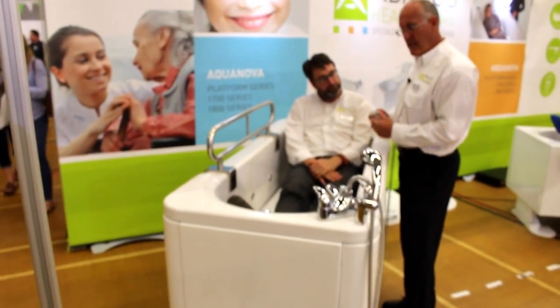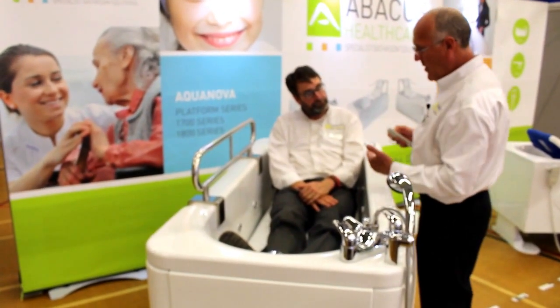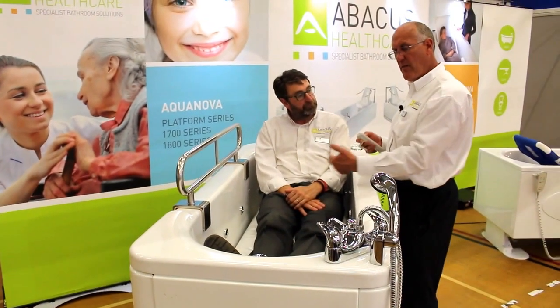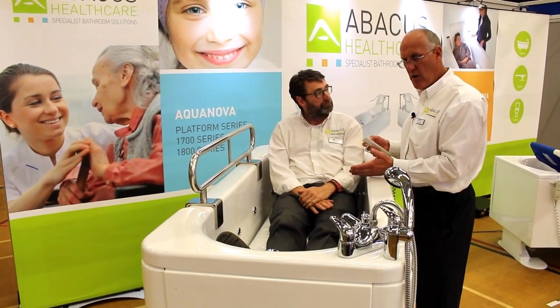One of the benefits of this is that Bob is at a much better height so we can have much better eye level contact, but also if I was to use a sling with Bob he's at a much better level for me to put the sling on or off, or in fact attach the sling to the hoist.